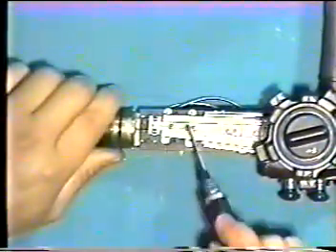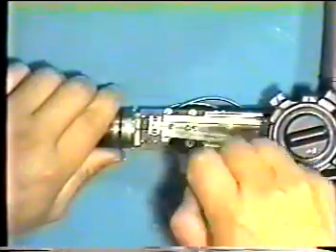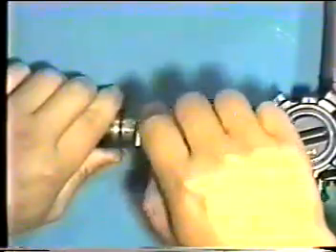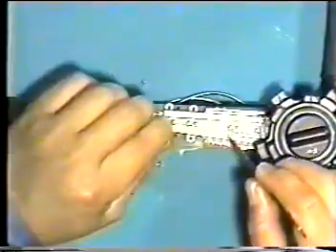Remove 4 screws, disassemble top and bottom wire stoppers. Make sure not to mix screws because several kinds of screws are used in the scope and they are dedicated to each part.